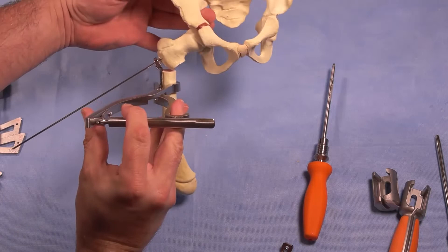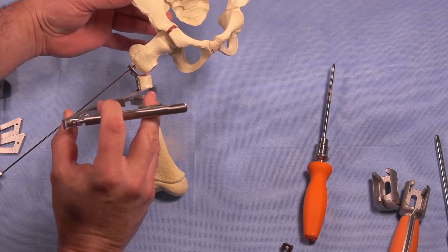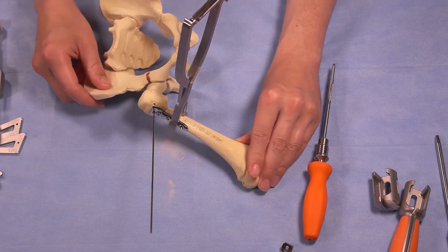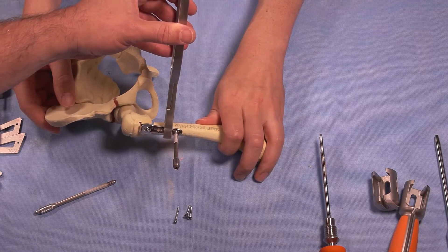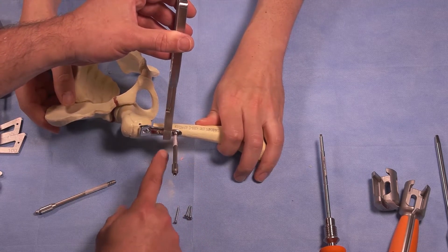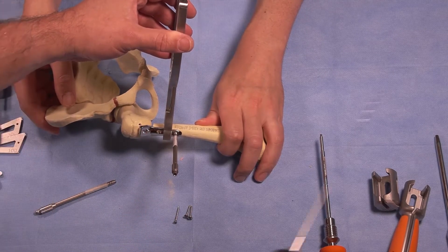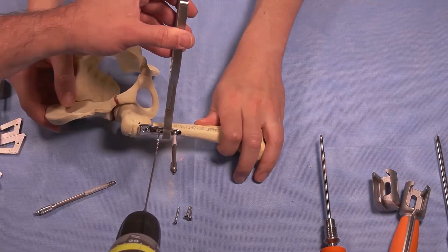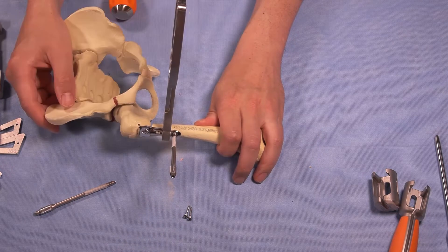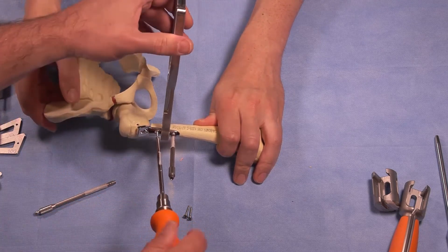Now we have reduced the angle of valgus. If this is what you like, we proceed to put our screws in and do a final impaction. We have both locking and non-locking screws. We're connecting the plate to the shaft after achieving the reduction in the proper neck shaft angulation. The proximal hole is a compression non-locking hole — I'm going to do a compression screw first, placed eccentrically in the hole for compression. As we compress, we'll loosen the verbruge.